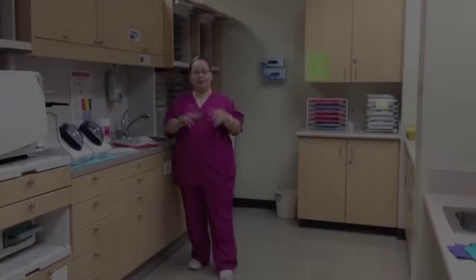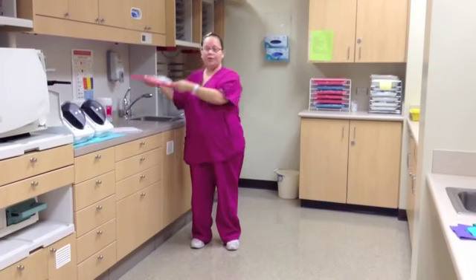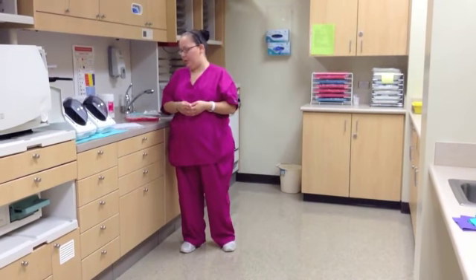Next, we will come to the sterilization room. What we're going to do is sterilize any instruments that need to be sterilized, and then we're going to set up trays, like so, for the next day. Then we will empty the ultrasonic solutions, turn off all equipment, and stock all the supplies necessary for the next day.